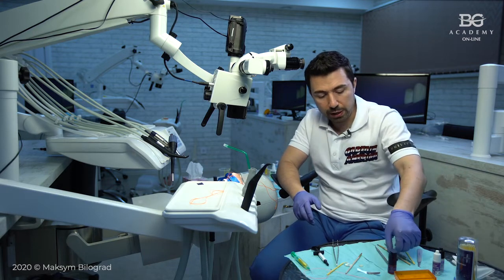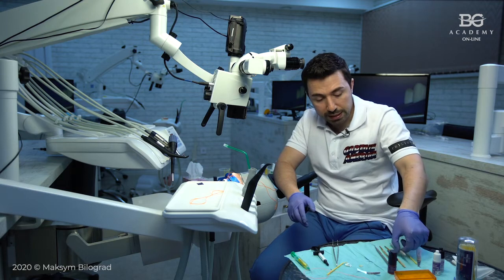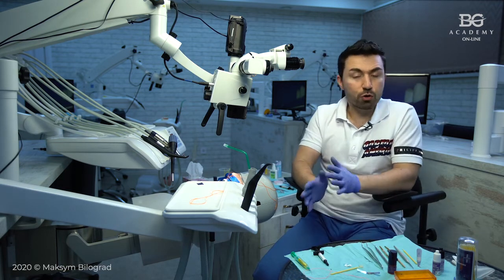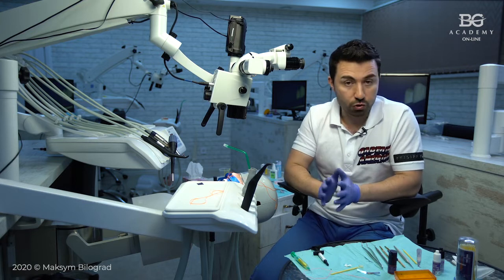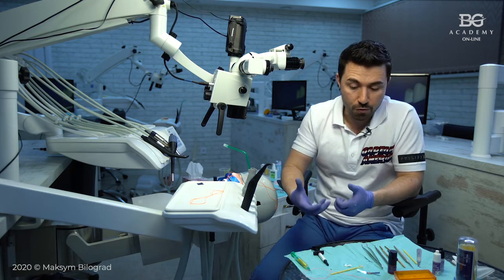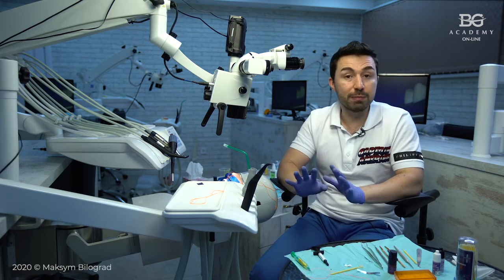cementation process. Now let us discuss a little bit regarding materials that can be utilized for bonding. Personally, as I mentioned, I prefer to use light curable materials to bond my veneers, and also overlays if I can, or crowns if the thickness is okay to be light cured through. I can use my light curable materials because I'm not limited in time.